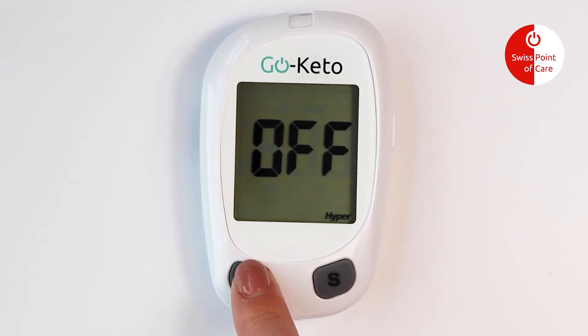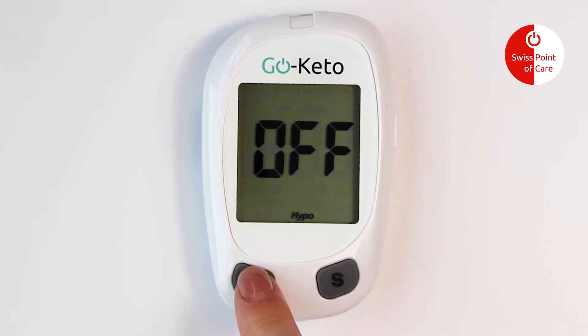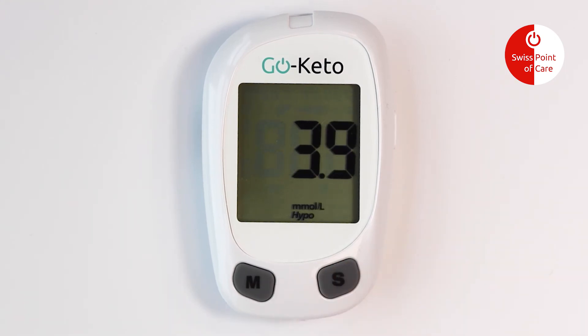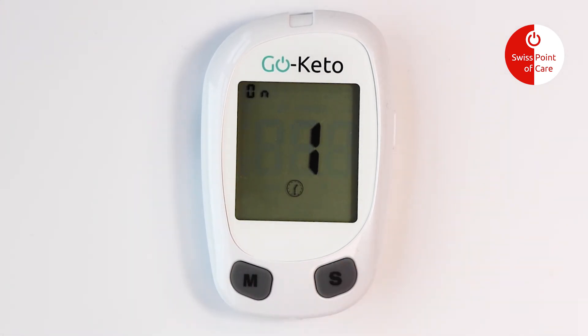Press the M button to switch the hyper indicator on and off. Press the S button to confirm your selection, and then press the M button to adjust the indicator level. Press the S button to save your choice. Use the same steps to set up the hypo indicator.